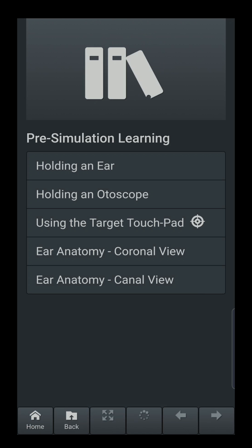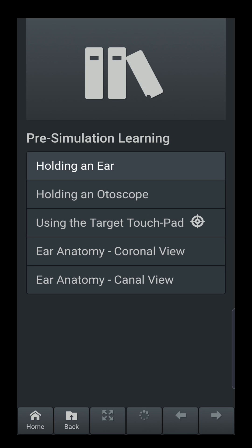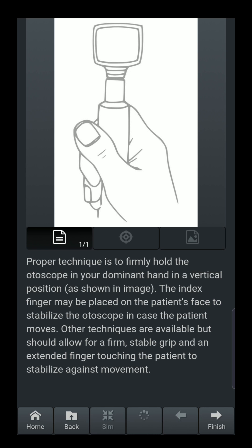We'll go through pre-sim learning. The first sections are designed to review some basics about otoscopy, how to maximize use of the otoscope, and review anatomy before we get into the simulation part. The first part, 'Holding the Ear,' shows you how to pull the ear upwards and back on the adult, and straight back and down on the pediatric patient to straighten the ear canal for proper viewing. When you finish a section, press 'Finish Section' and it goes back to the sub-menu. Next is holding the otoscope — techniques to hold the otoscope.